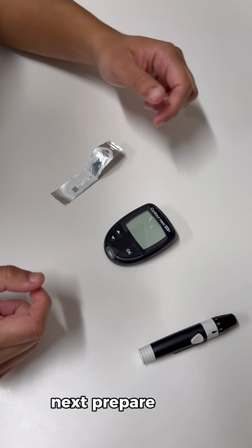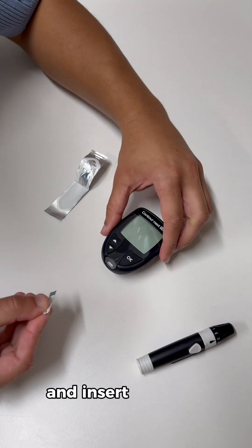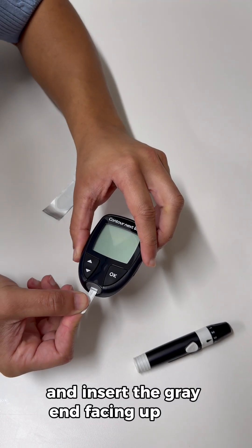Next, prepare your meter. Take out the test strip and insert the gray end facing up into the meter.